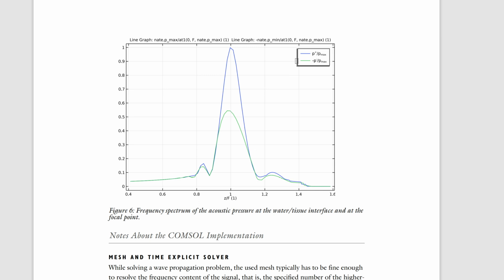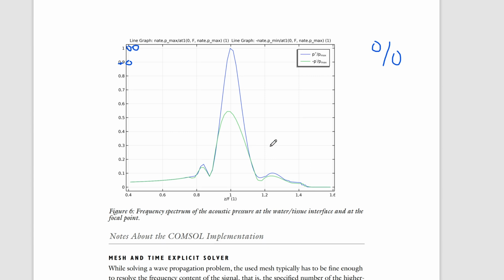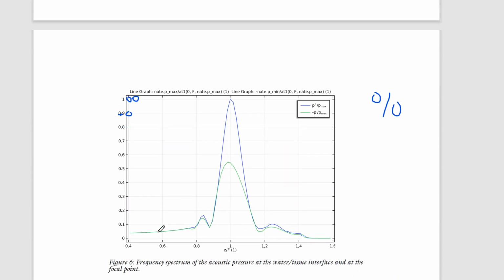But they're divided by the maximum. So we're actually here not getting the actual pressures, but we are getting a percentage. Not really a percentage, because this would have to be 100%. It's a ratio. We're getting a ratio. 90%. You know, I like thinking about percents more than ratios. So 100%, this. And this one. And these guys, smaller relative to the maximum.